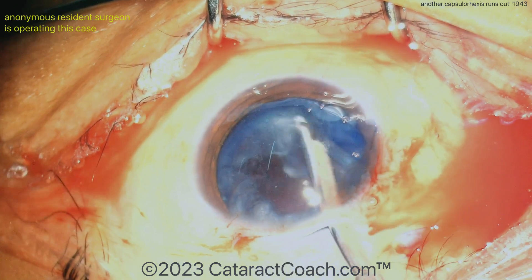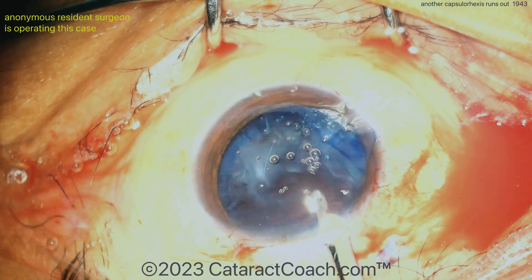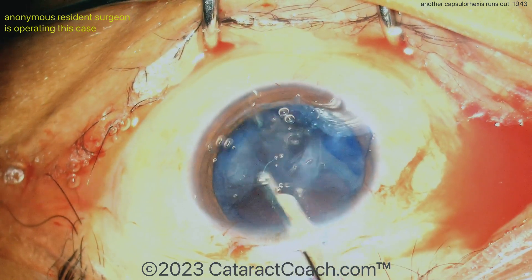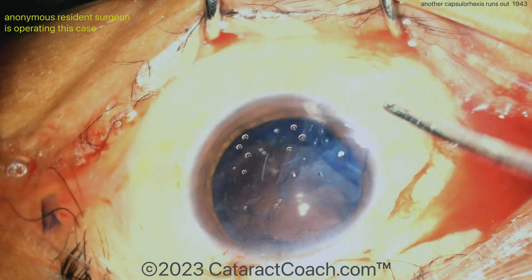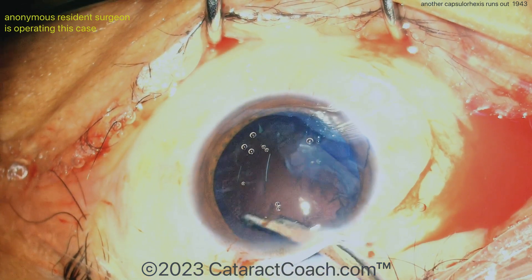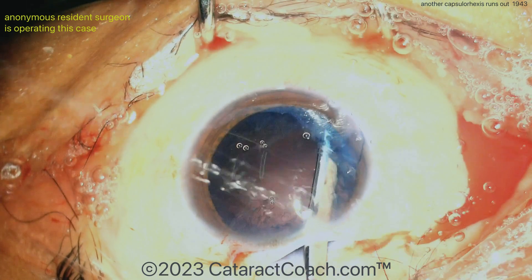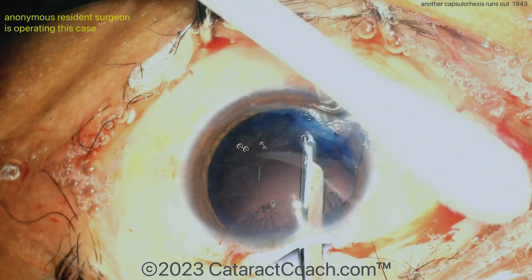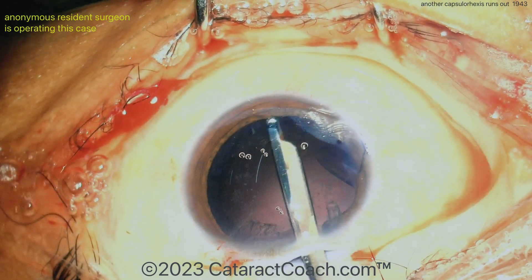Now the case can be finished. There's the Simcoe cannula going into the main incision — obviously it leaks a lot. You're going to need to go through that paracentesis as well to clean up. This patient will be very happy — a very nice technique and the patient's going to have much better vision. But we need better than that; we need to have that intact rhexis. We want to give patients the very best, and you don't want to have this run-out rhexis in your cases.